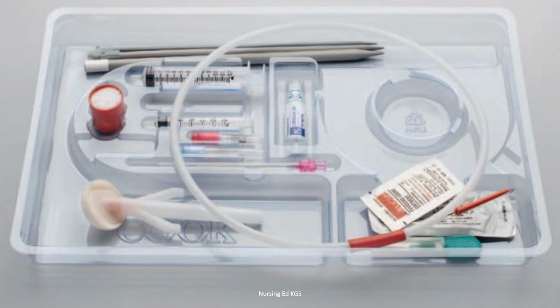You'll also ensure that there's a stethoscope at the bedside as well as a 500 ml bottle of sterile water. You will also get sterile gloves, gown, mask, and 1 to 2 sterile towels. If suture equipment is not in the tray, you'll need to get suture equipment or material and a scalpel blade.